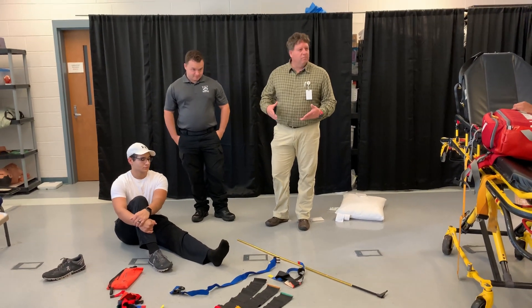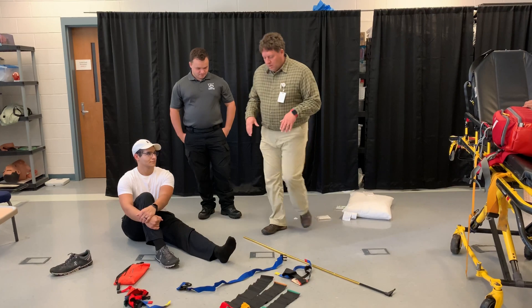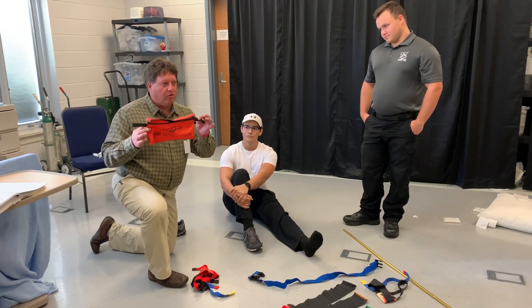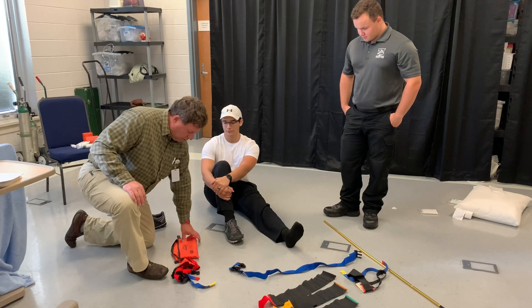Our Optimum traction device is a little bit more compact. You saw that compared to Hare traction and similar devices — that's as big as it is, so a lot of services are going to prefer it just because it's easier to store. But the ideas are the same.